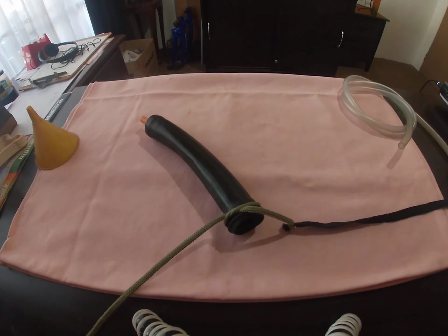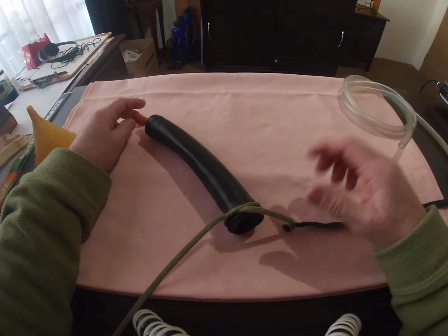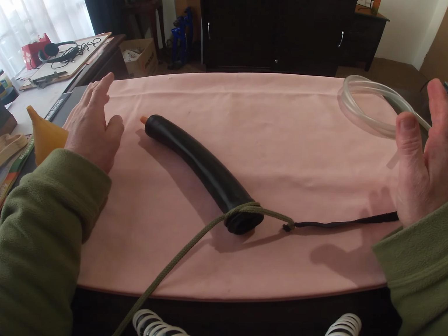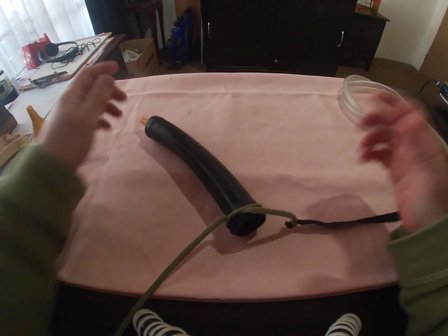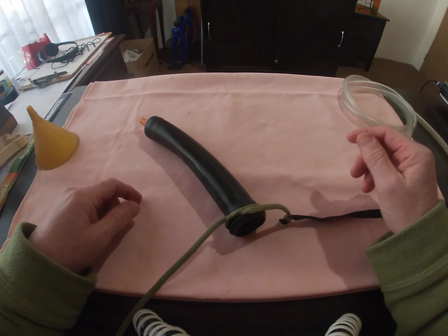obviously the shoelaces will pull it towards your body. So I never had any problem with any slips. So the concept works very well, and maybe something different will work for you, but this really did the trick for me.